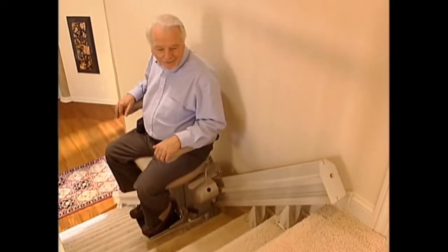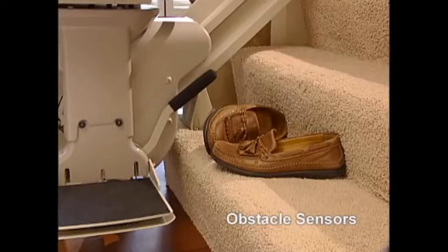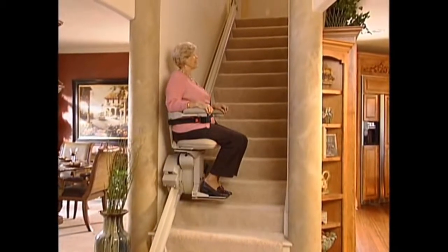But it's not just styling that sets the ElectraRide Elite apart. Look at these wonderful features: sensors that detect any obstacles on the stairs. The Elite moves up and down your staircase with power and efficiency.